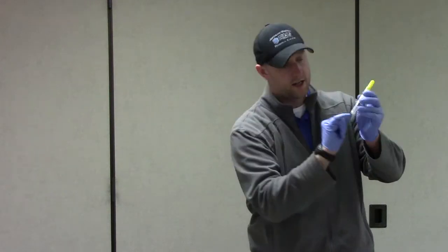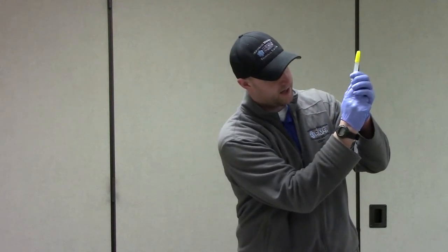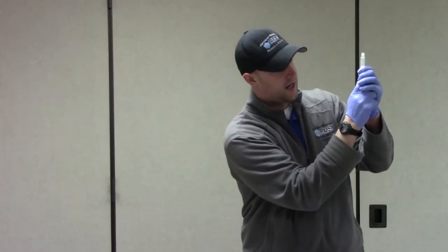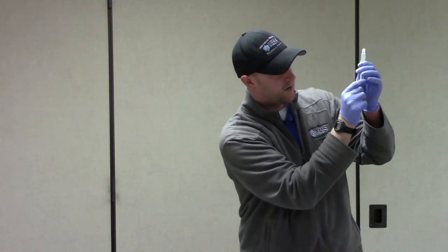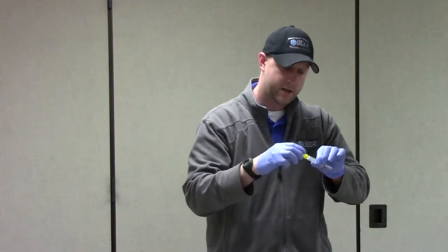As I look inside, I can see there's a little bit of air, so I loosen up the cap and dispel the air. I'm at the 0 now, and we're ready to administer our medication.